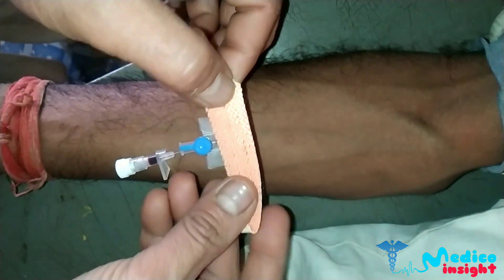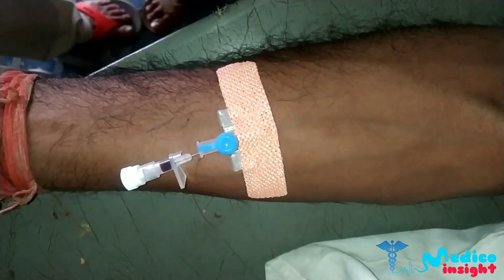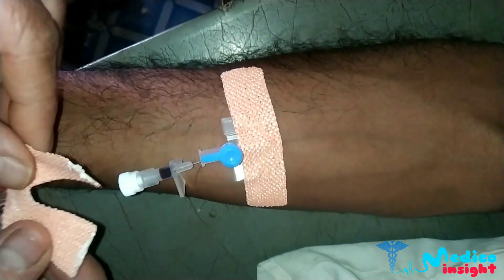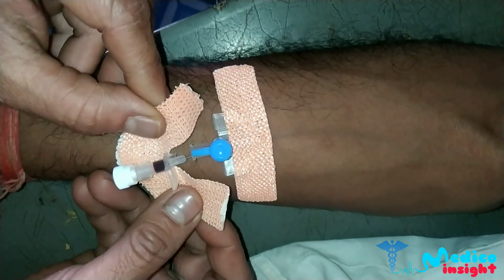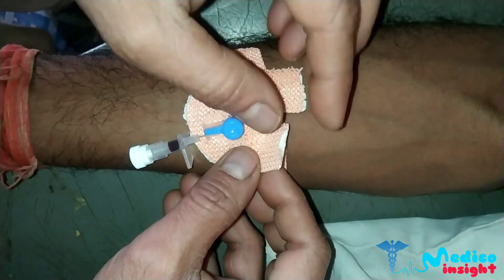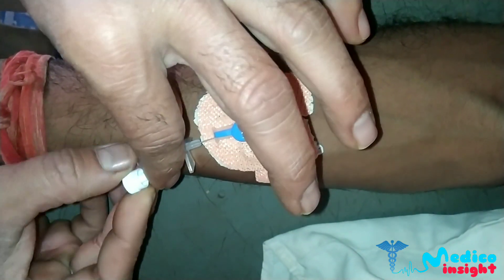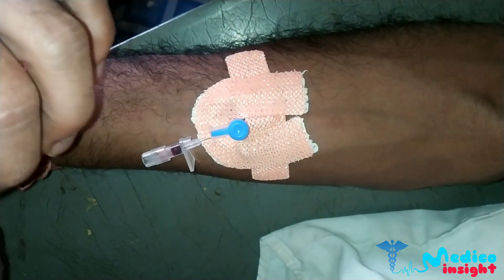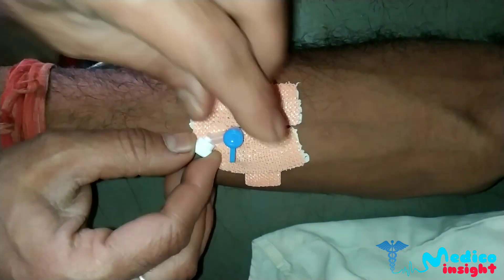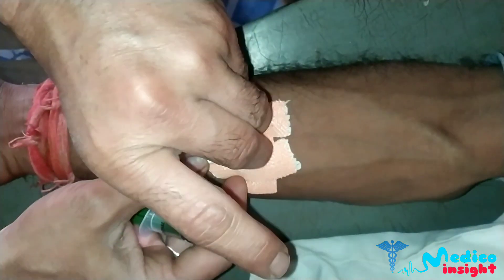Apply the dressing to the cannula to fix it in place. As we can see, the dressing is applied. Then remove the needle fully and dispose of it into the sharps bin. Put the cap on the end of the cannula — blood can be seen in the hub of the cannula.